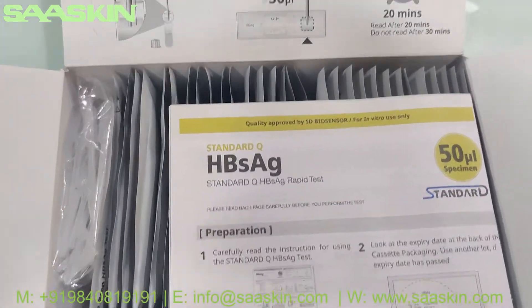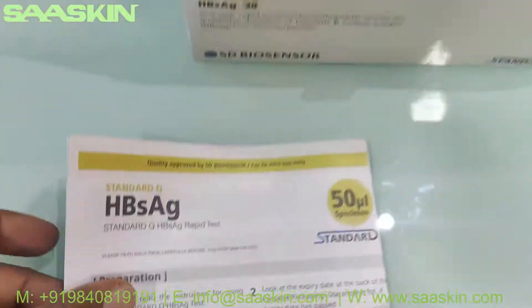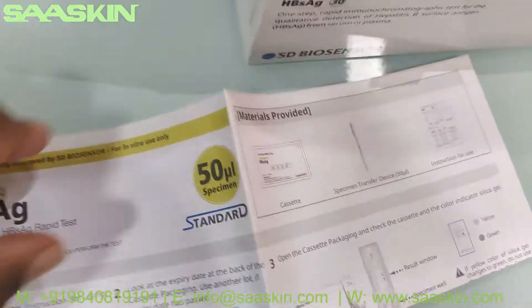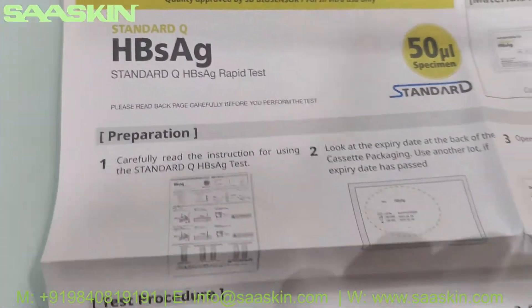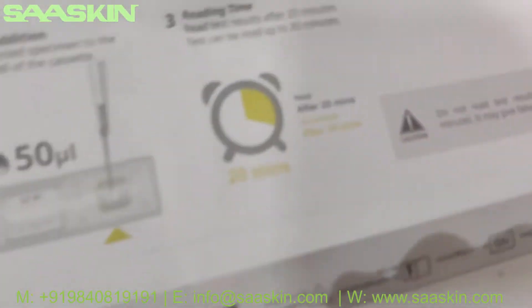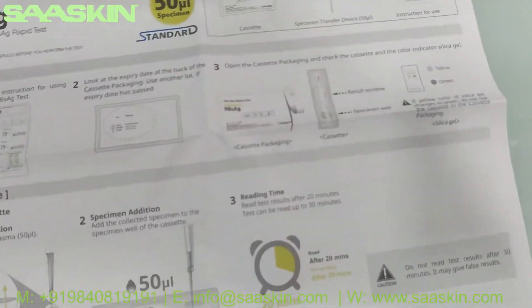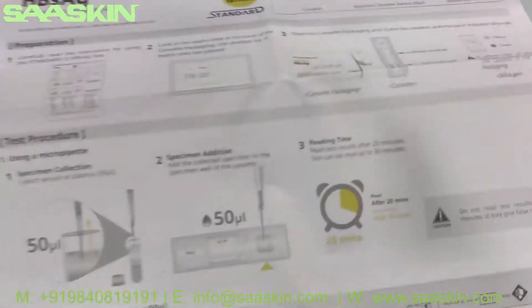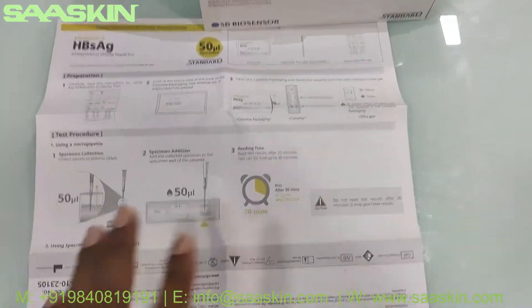Inside the box you've got the instruction for use — there's a complete detailed brochure that talks about the company details, sample preparation, and test procedure. You also get details on how to interpret the results. This is the total instruction for use manual inside.